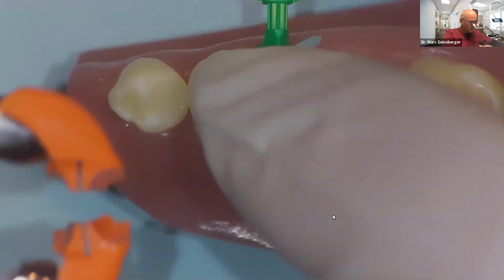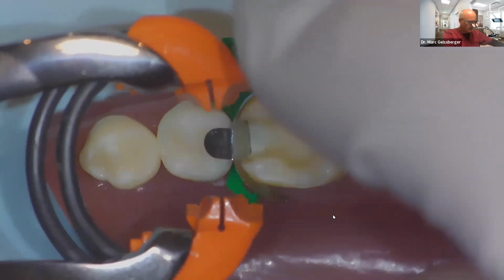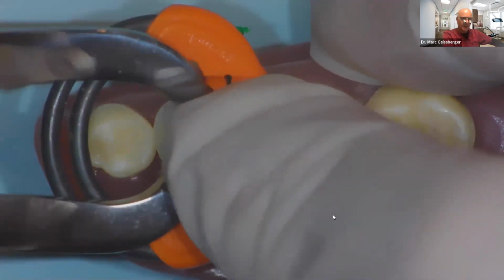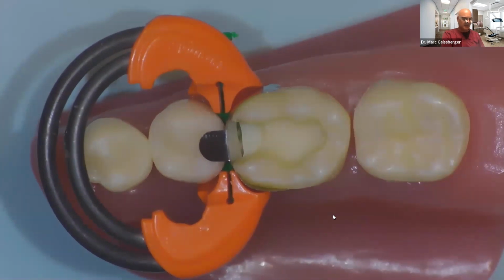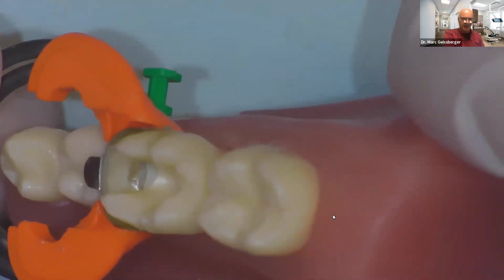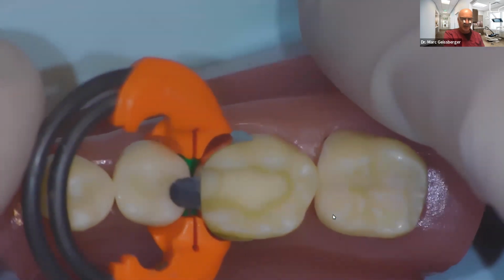Now, one little trick in placing clamps is to get in the habit of trying to hold down your matrix band. So I open this really wide, very wide. I slide in from the mesial, and before I let go, I put my finger on top of the entire system so that the matrix band doesn't shift. Now, when we look at this, you can see I'm sealed cervically. What you were seeing before is just a little shadow there. I've got that all the way sealed.